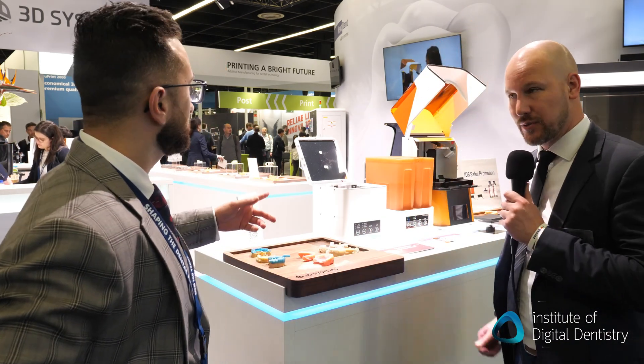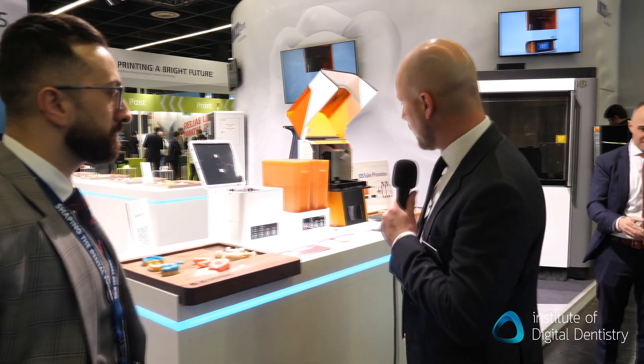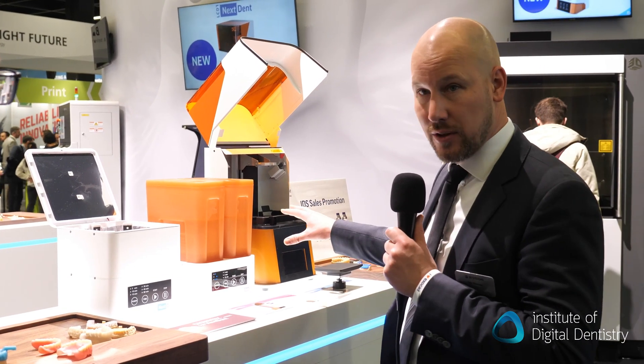Over here, we have our new LCD-1 3D printer. NextDent is known for the NextDent 5100, which is a high-speed DLP printer. But to bridge the gap in the portfolio, we announced this LCD-1, a small desktop printer with LCD technology.